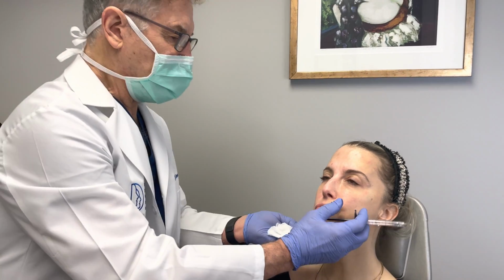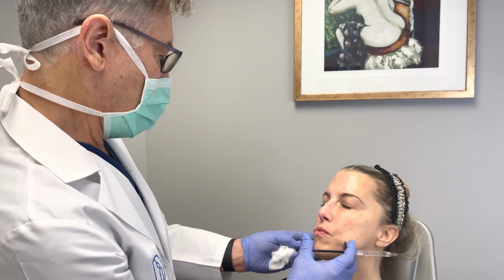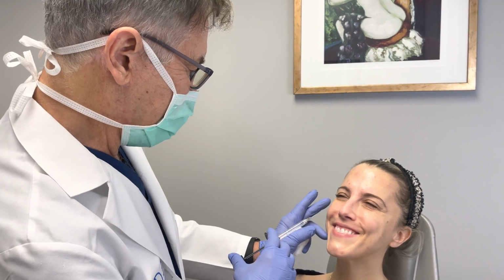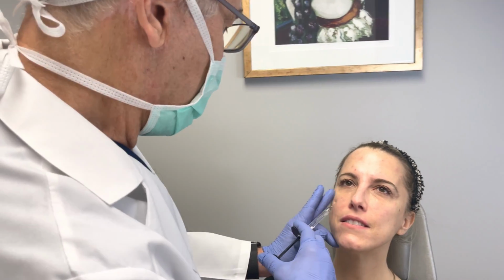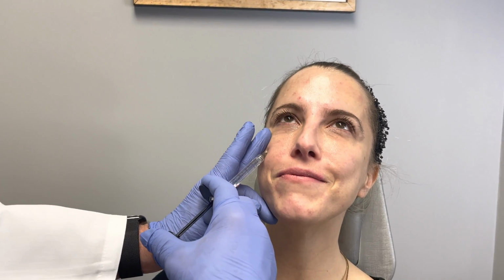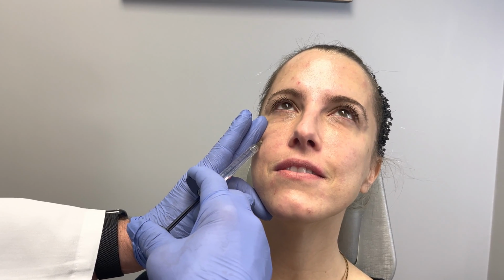So she's already been numbed. We've done a little block on her. So we'll first use, let's see, we'll go to this side first. So smile and relax. So again, does that hurt at all? Debbie, you okay? Nope. A little pinchy, a little bit. So we're adding the Contour.